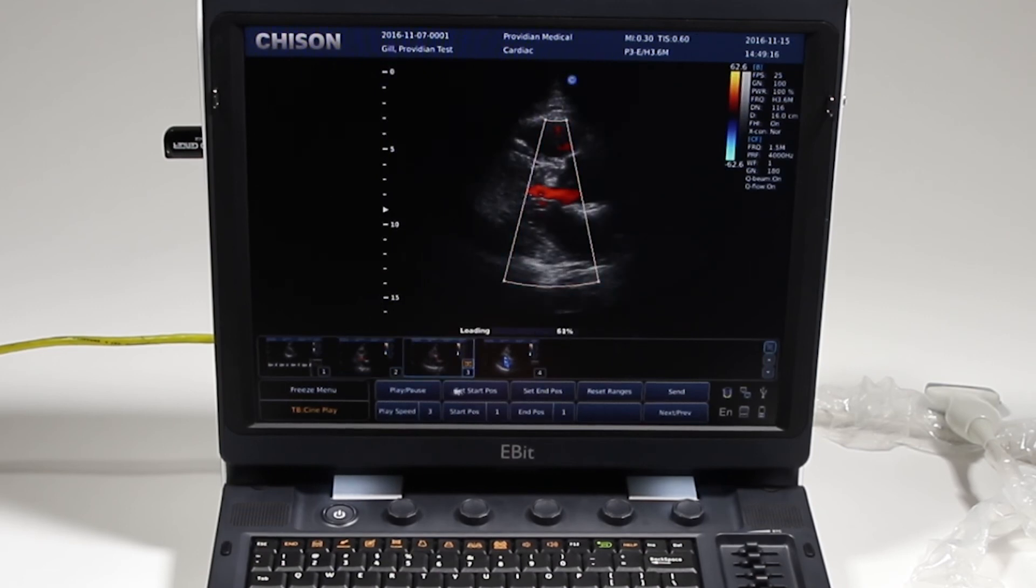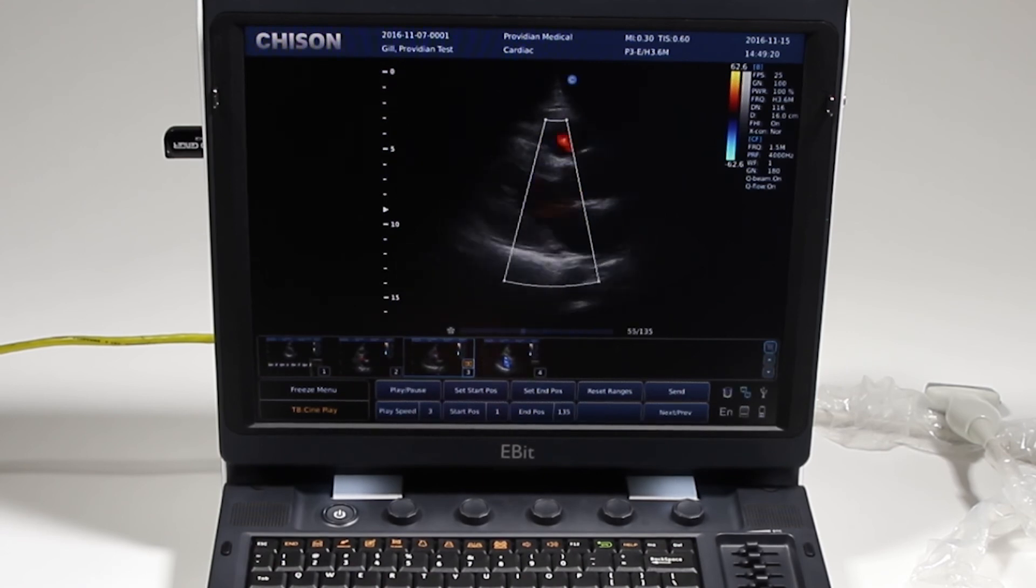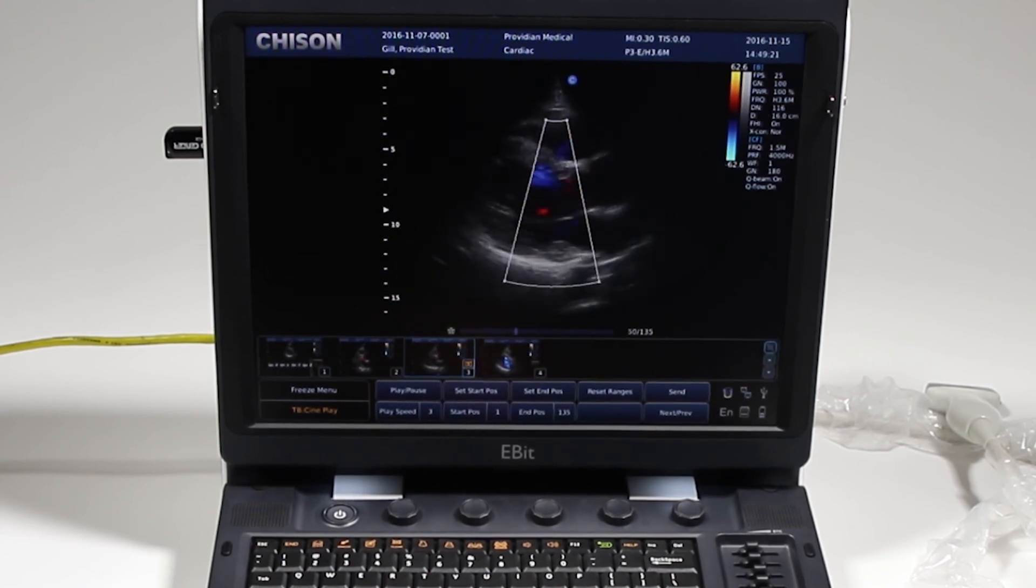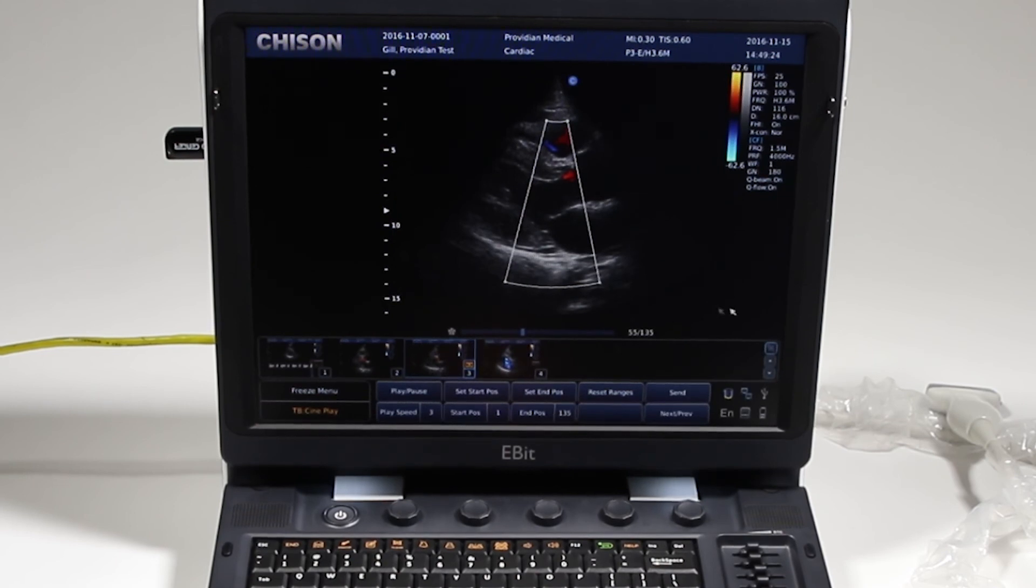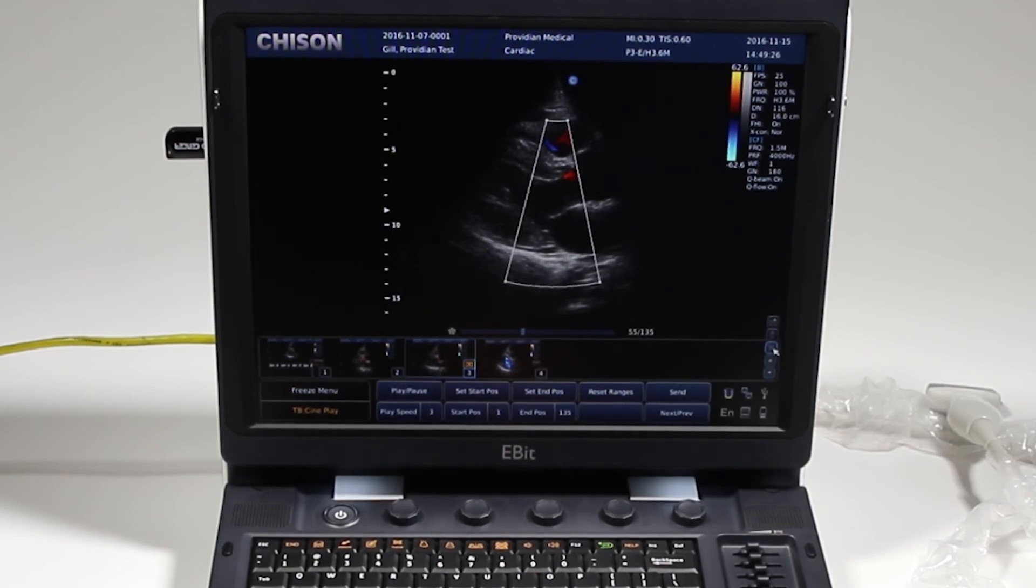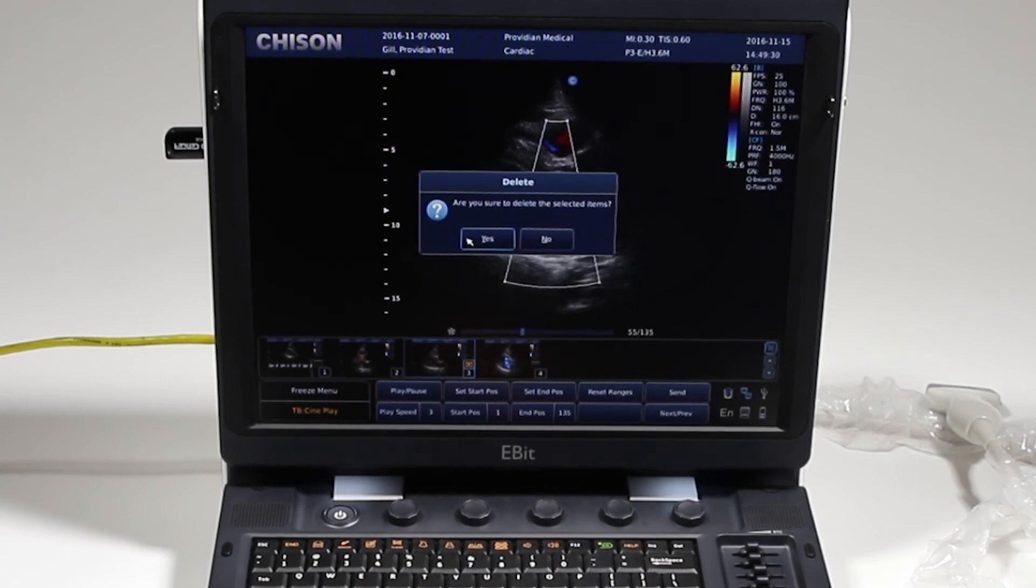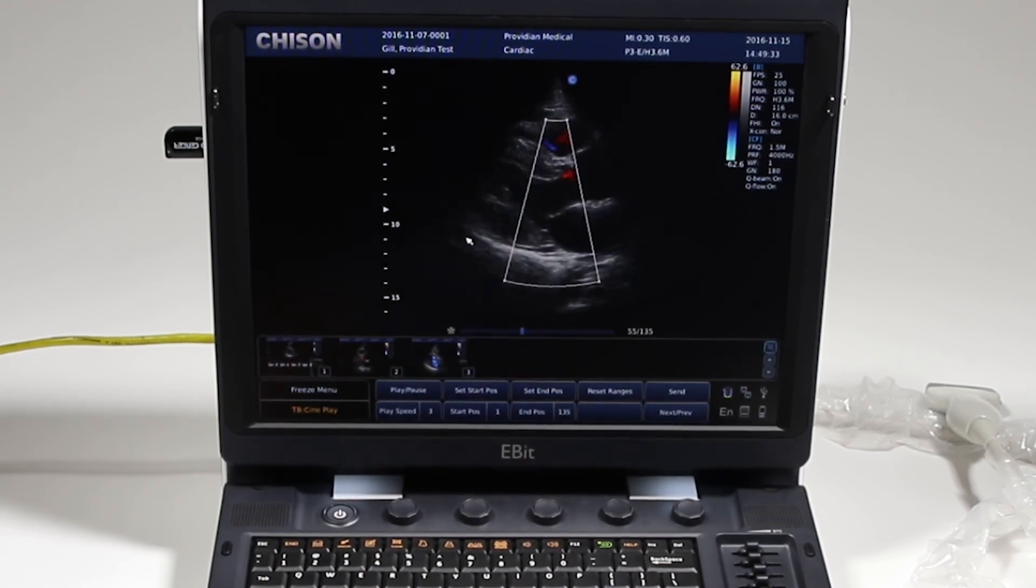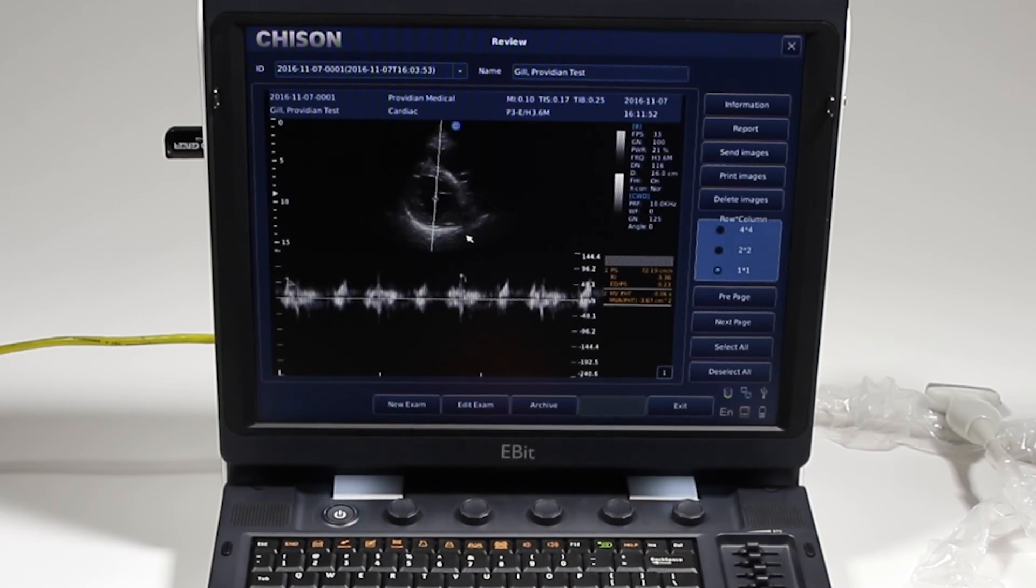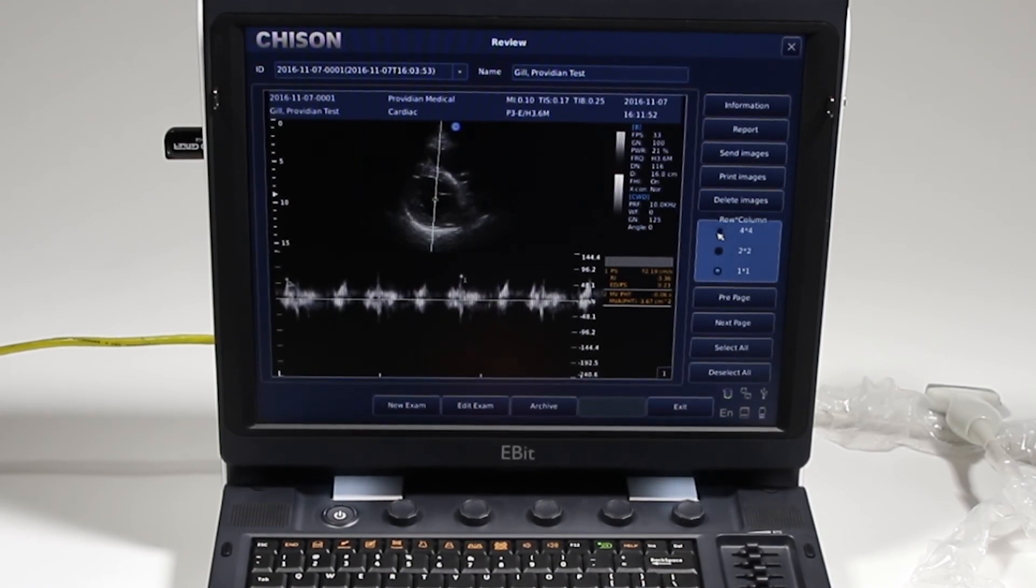I can play and pause the cine, scroll through. Again, I'll hit the cursor, and I can scroll back through. I can also delete the images from here. If I didn't like that image, I can go ahead and click delete. I can just click archive to go back to the archive, and I'm back here at this screen with this exam.